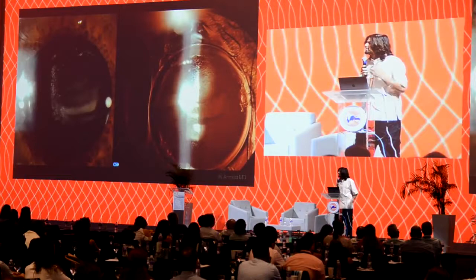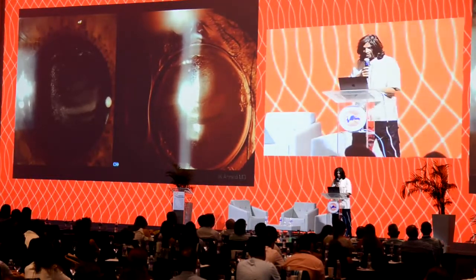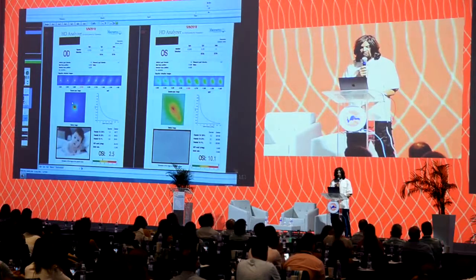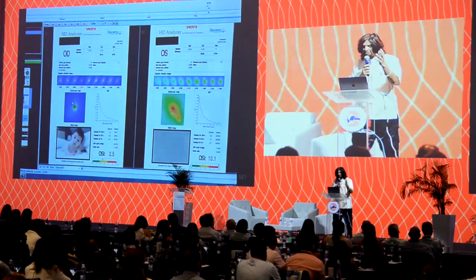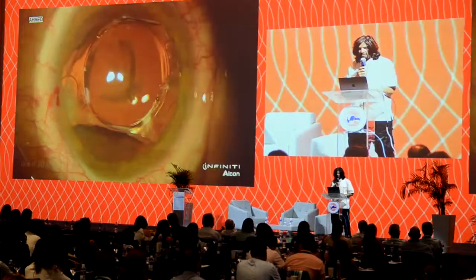Anyone know what's going on here? This is calcification from a hydrophilic lens. This is the HD Analyzer. It's a double pass technology looking at ocular scatter. This is the right eye, minimal scatter. The left eye, you can see the calcification causes intense scatter. Lots of glare and big problems here.